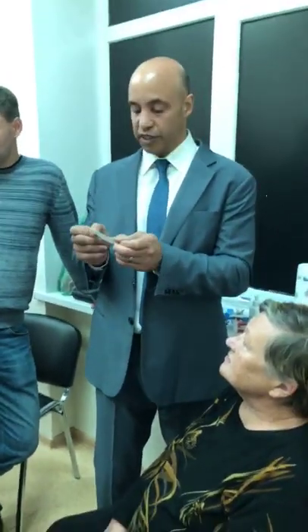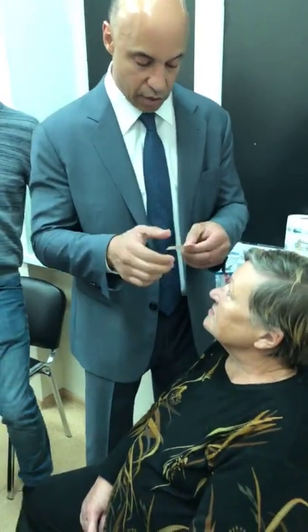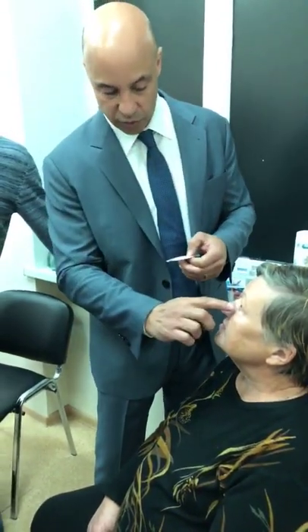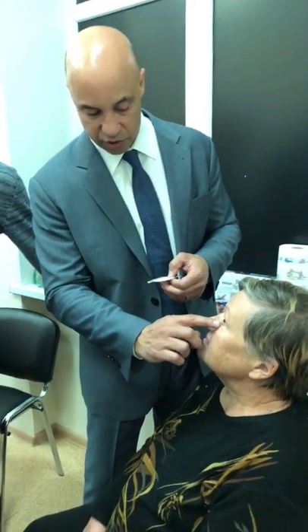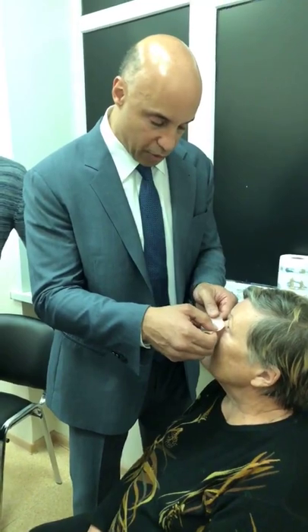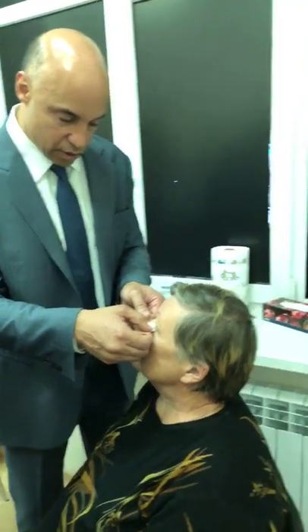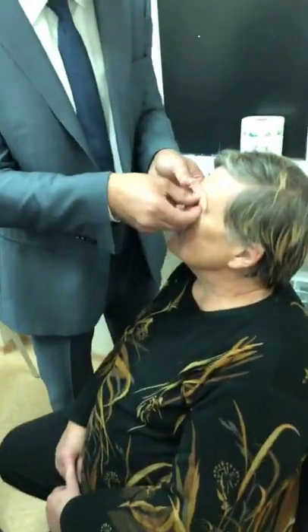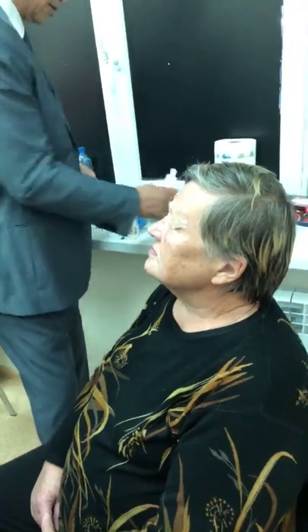So the goal with these shields is to make sure that the patient's eyes are going to be closed. The reason why I made it thinner is because we want exposure of that lid margin there so that we can actually get some energy to the meibomian glands. So, Toto, close. Good. Okay. That actually works pretty good.